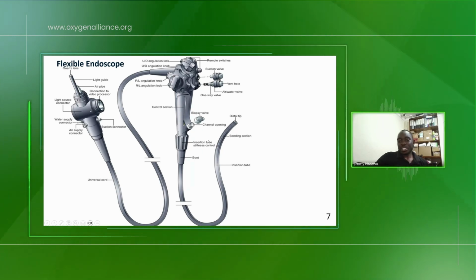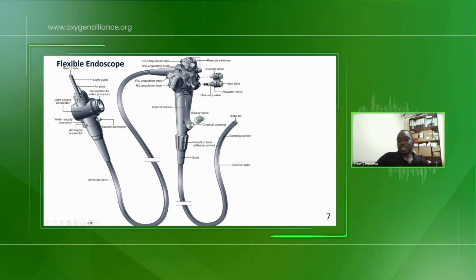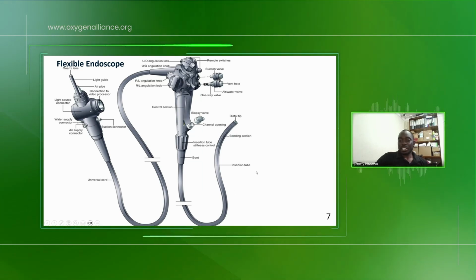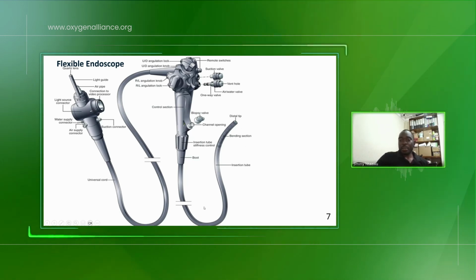The insertion section, this one here, follows the bending section, and it's just flexible. And where the bending goes is where the insertion follows. It's called the insertion section because this is the area that is inserted into the patient.